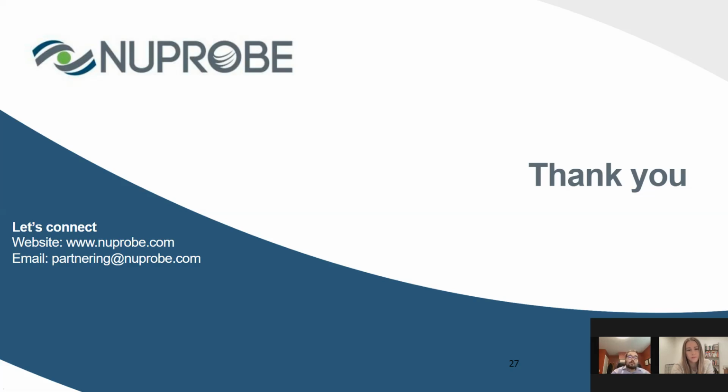I also want to point out, since bioinformatics can sometimes be a bit of a black box, I think the most powerful piece of data that we showed in this webinar is that we highlighted some data from the publication where we did actually compare the quantitation accuracy of quantitative blocker displacement amplification against UMI NGS without enrichment, and showed good concordance between those two methods, showing that our method, in spite of altering the VAF during enrichment, is able to quantify the original VAF of the sample.